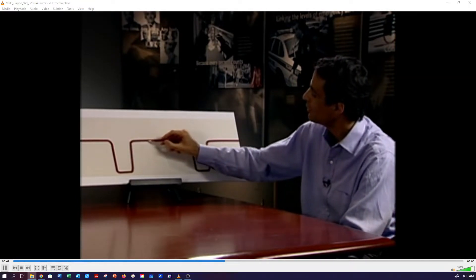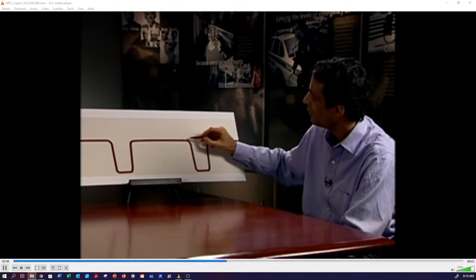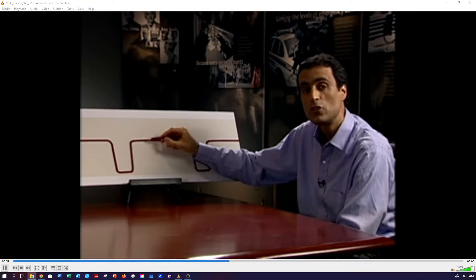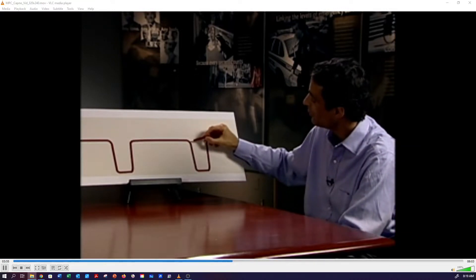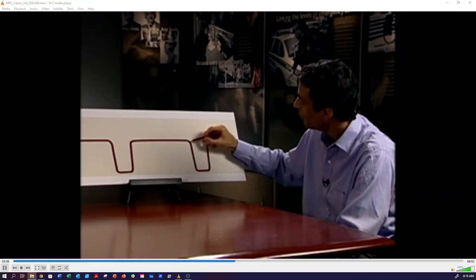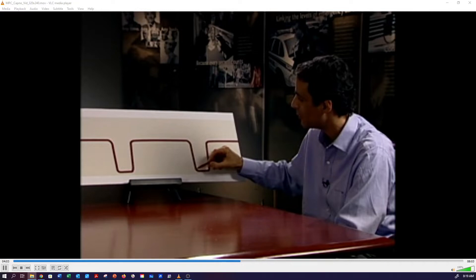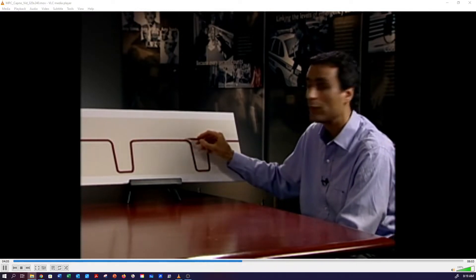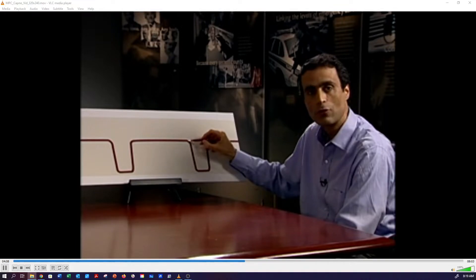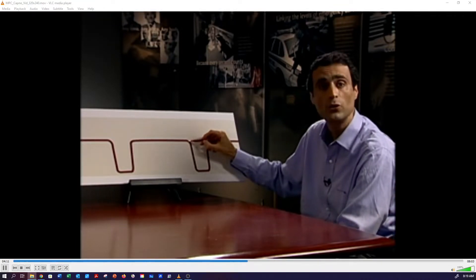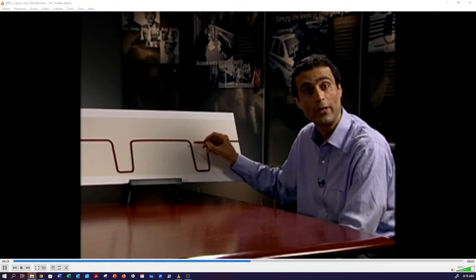The waveform represents CO2 concentration over time and has three critical elements. One: the ascending phase, which represents the rapid increase in CO2 concentration during early exhalation. Two: the gently sloping alveolar plateau, which represents the uniform concentration of CO2 from alveolus to nose. And three: the descending phase, which represents the beginning of inhalation where CO2 concentration rapidly drops back to zero. The end of the alveolar plateau represents the maximal concentration of CO2 in the breath — this is called the end-tidal CO2, the number you see on your monitor. Just like changes in the ECG waveform can have significance, so can changes in the CO2 waveform.